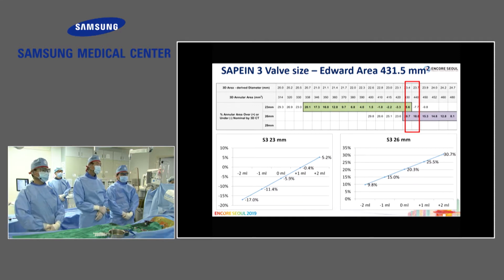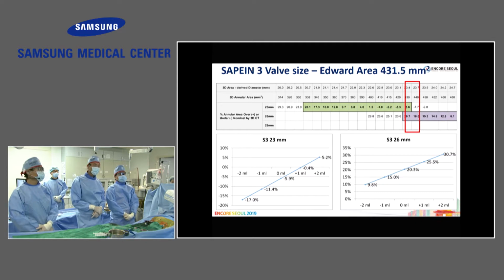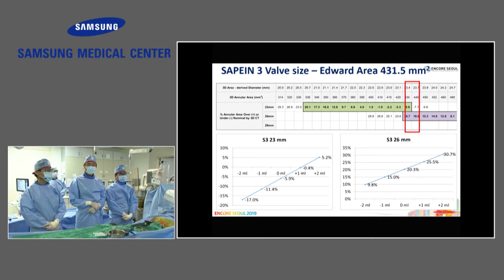Actually, one of the issues is the role of FFR in coronary intermediate lesions in patients prepared for the TAVI procedure. These are old-age patients, and the FFR cutoff value of 0.8 is not a good indicator for ischemia in old-age patients with poor exercise capacity.